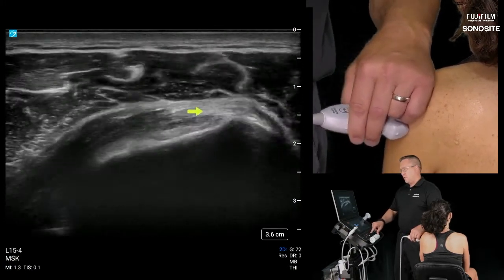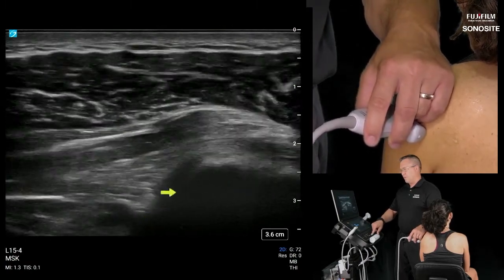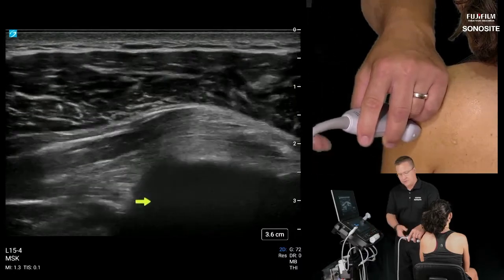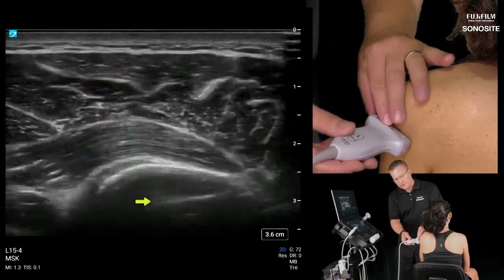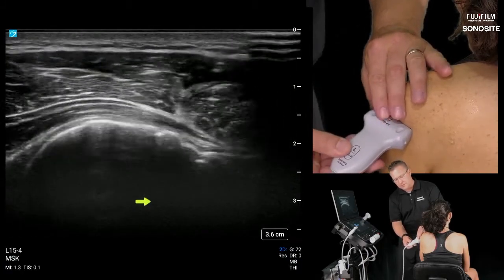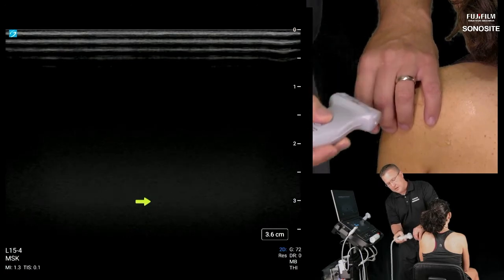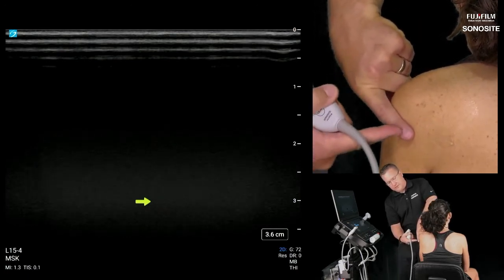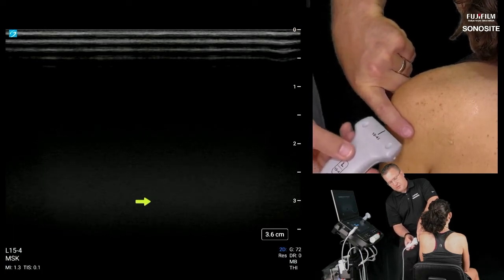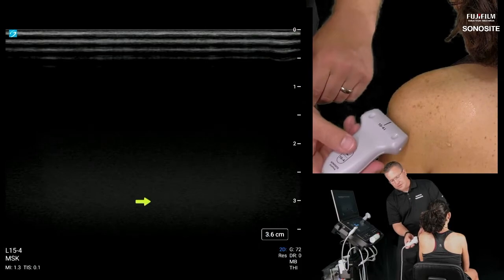And as I go more proximal, if I don't see a nice bony backboard of a landmark down here, what you want to do, because we're scanning, now we're on the ball of the humeral head, right? You're going to want to drop the transducer inferiorly and aim up, because we're scanning the surface of a ball. Remember, we need to aim up into the ball, and the goal here is to pinch that teres minor tendon between your transducer and the humeral head. That way we have a skeletal reference point in the image.